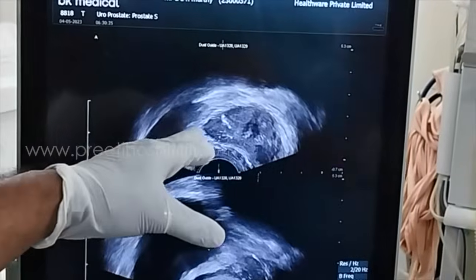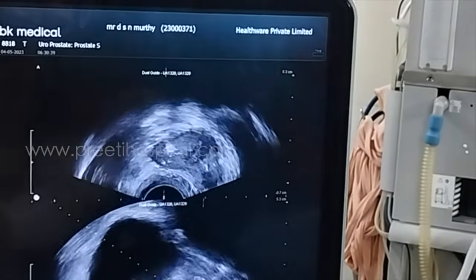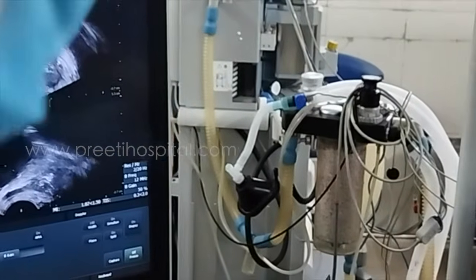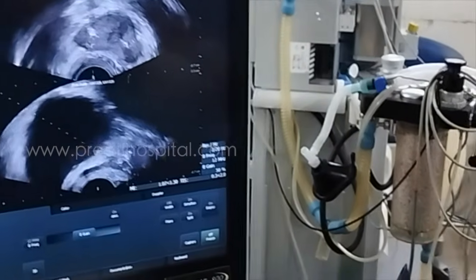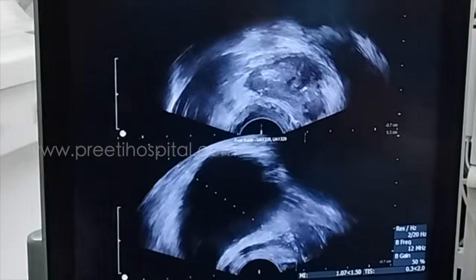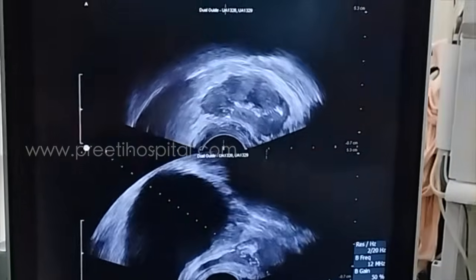So now you are planning to do side firing at the base. Yes, right side. This is extra side firing at the base. Lateral first. This is lateral, right side. Write it down.